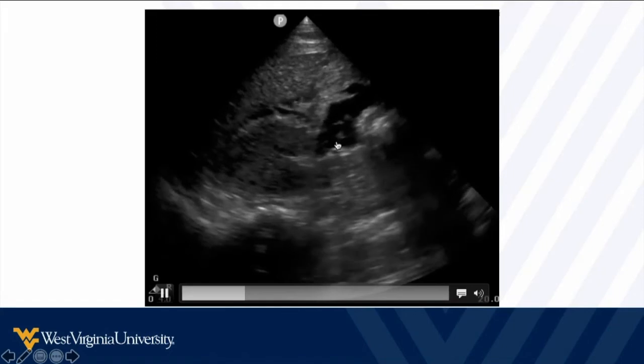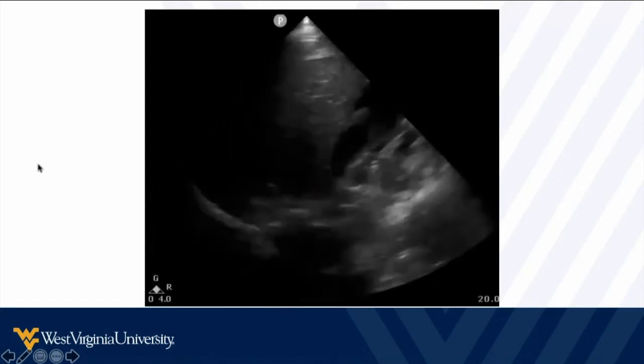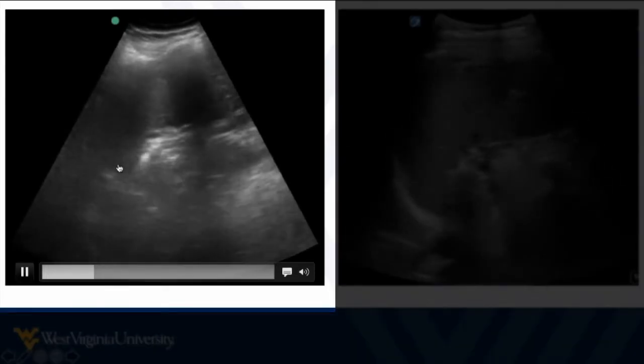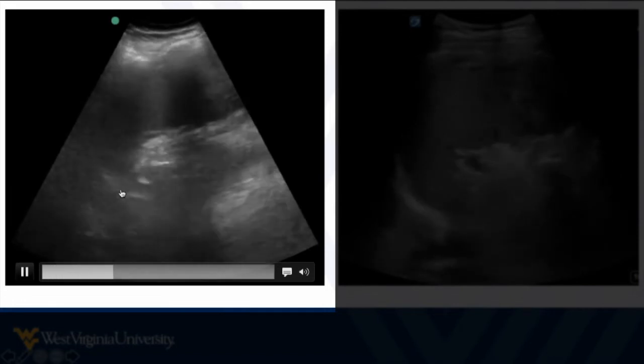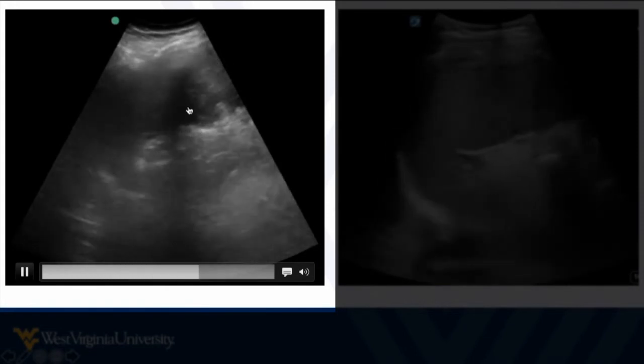So just be complete, with good fanning movements as you examine the abdomen to find these areas of bleeding. Here's another case that's a little bit subtle. We're on the left side here, and we see that the spleen does not take on its normal contour. It should be kind of this nice pointy crescent moon, but it takes on this bulbous appearance here.